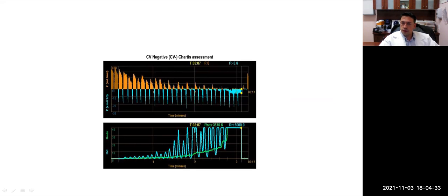The flow will disappear because the balloon's inflated. And then at the same time, I'm not sure because I'm not used to looking at this graph. It doesn't show up on my machine. But this is reciprocal increase in airway resistance, which is saying the same thing.